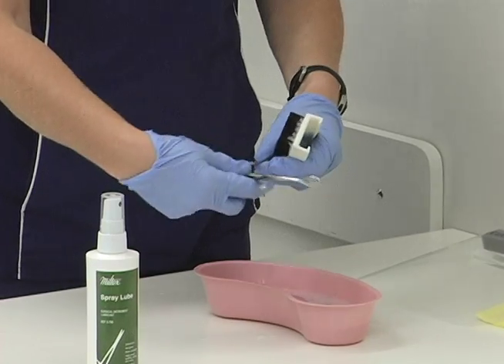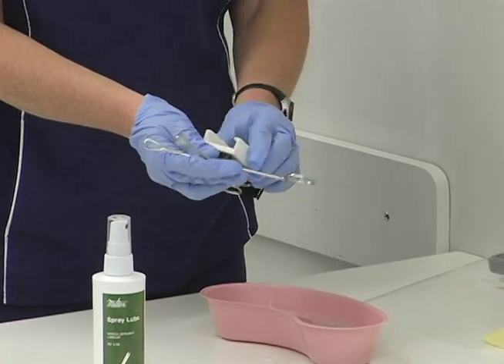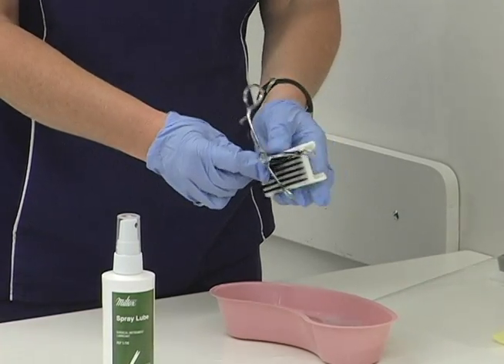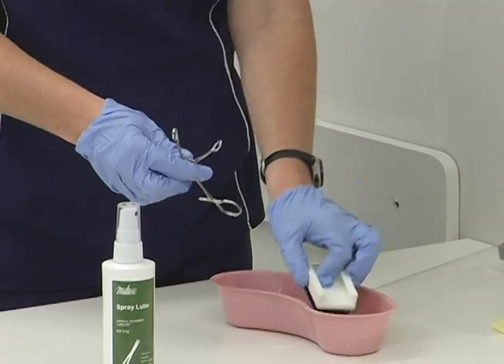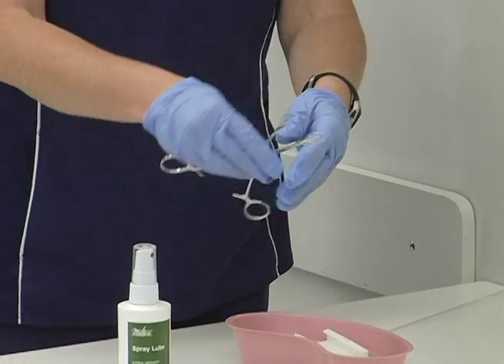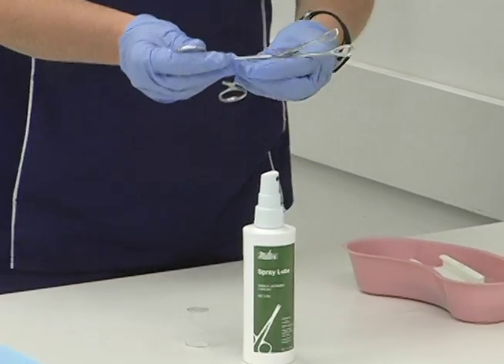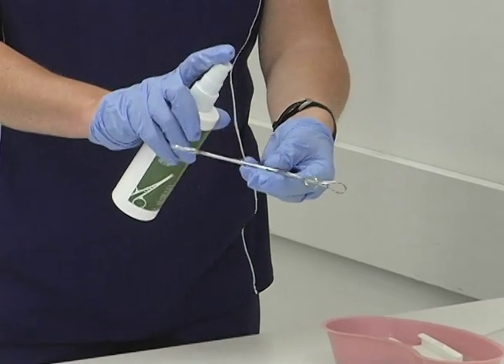Picking up my instrument — if it is a hinged instrument, you want to make sure that it is open and scrub all the little crevices real well. Scrub it under running water, then rinse it under the running water. Check to see if it needs a lubricant in the hinged area, and if so, go ahead and spray.